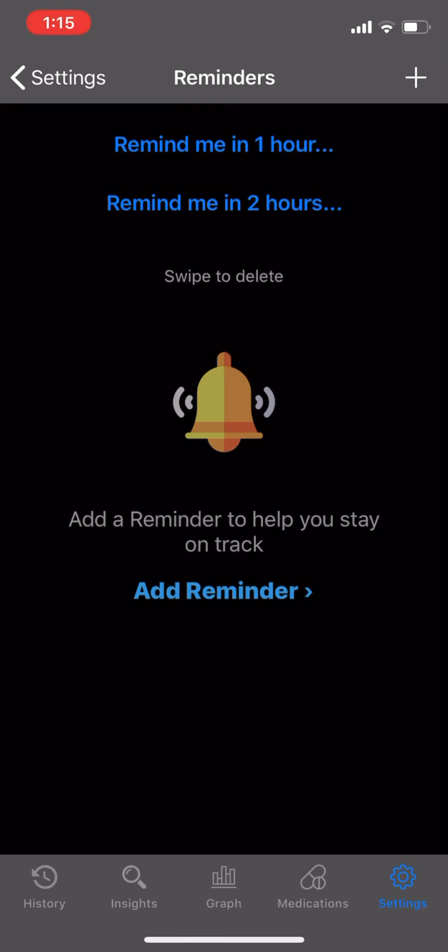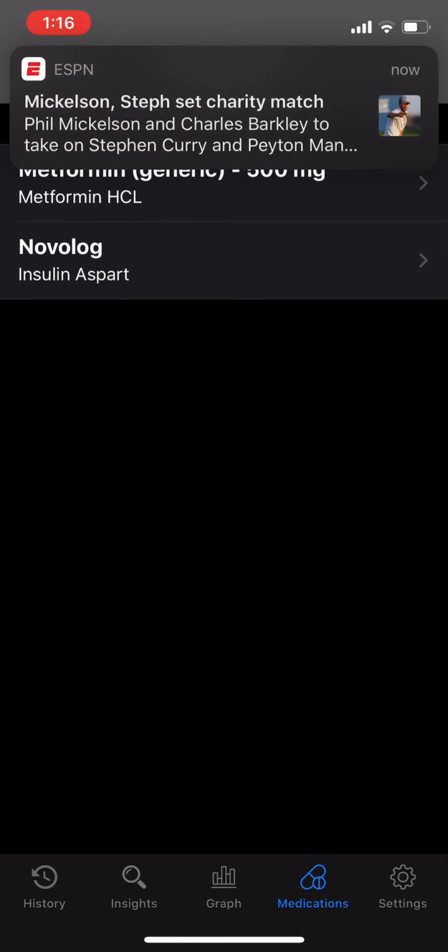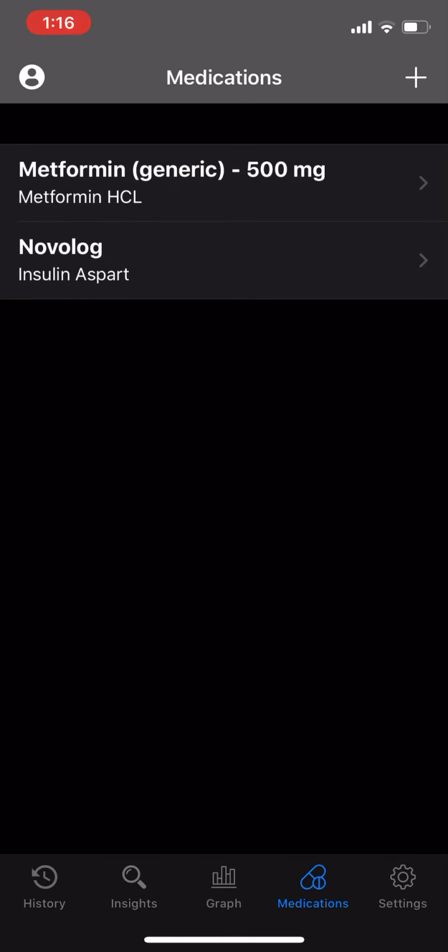And finally, we have operational, which has to do with the business team and business model, which I think the overall purpose of the app and being able to monetize it in that way, I think it's a pretty good idea overall. And I like the features that they have, a lot of customization. They do have the graph to keep users coming back time and time again. So overall, I think I'll give this a 7 out of 10 as well. So if you give me 1 second, I'll add all that up.